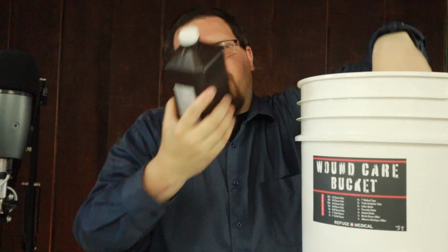Now, they did throw in the bucket some hydrogen peroxide and some alcohol. This stuff's dirt cheap. You should have more than what's in this bucket. You should have more stocked up. Hydrogen peroxide is useful for indoor gardening as antifungal stuff. Also antifungal on you if you need it. So if you get something on your toes, or you get some trench foot, you're going to want to have some hydrogen peroxide for that. Also good for sterilization. Alcohol, you need more alcohol than this. I got a couple flats of rubbing alcohol. It's dirt cheap. Go get some.